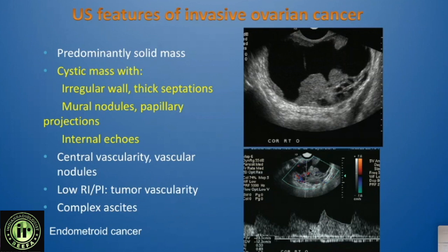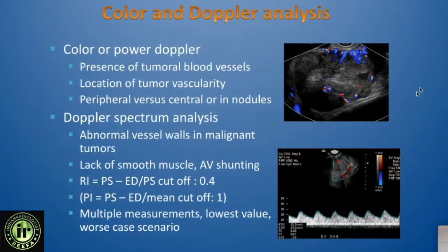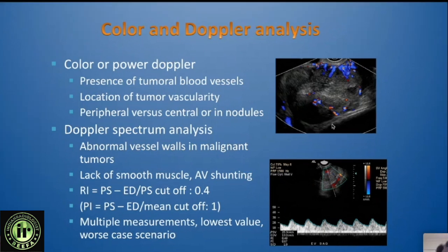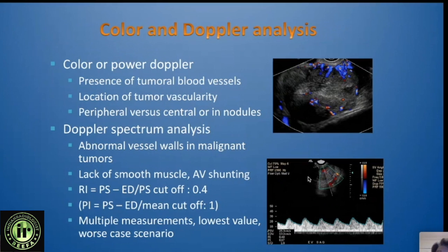You can see low resistance flow within the vascularity, and the presence of ascites is also a concerning sign. This case turned out to be an endometrioid cancer. Vascularity is important because we are trying to confirm the presence of tumor vessels, which can be peripheral or central. These abnormal vessels lack smooth muscle, tend to have AV shunting, and therefore show forward flow in diastole with a low resistance index.